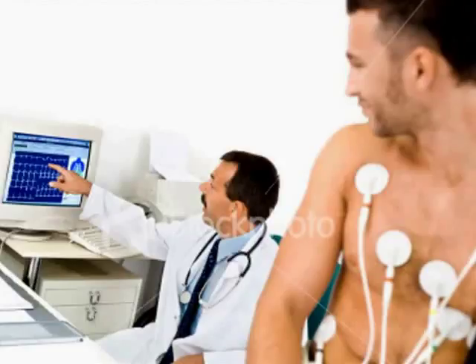Again, the ECG also provides information on the orientation of the heart in the chest, the conduction disturbances that are seen in a particular heart, the electrical effects of medications and electrolytes, any mass of cardiac muscle, as well as the presence of ischemia related damage.